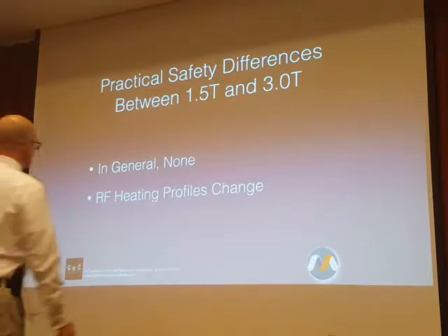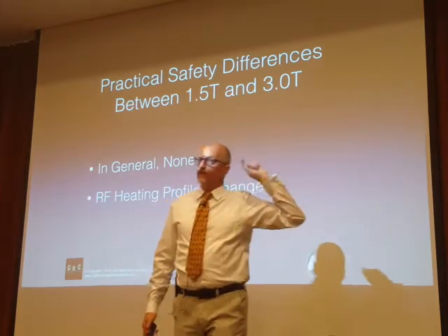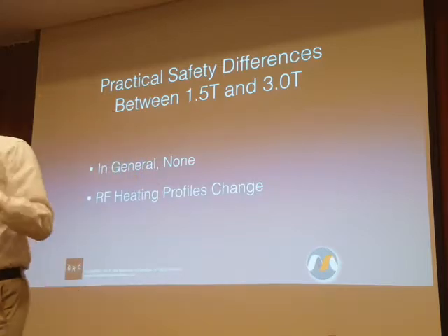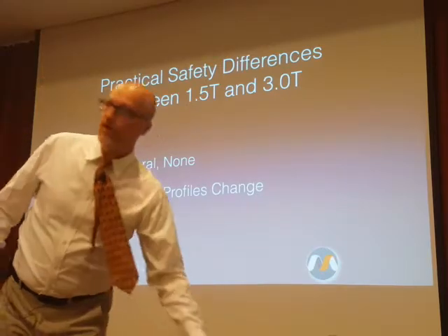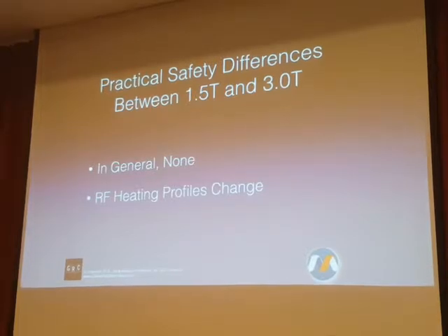Where the difference does come into play is with specific heating parameters. So we talked about radio frequency heating, and that one of the mechanisms of radio frequency heating is an electrically conductive element in the bore with the patient, right? There's what's called resonant circuit heating. You can think of this as the antenna effect.